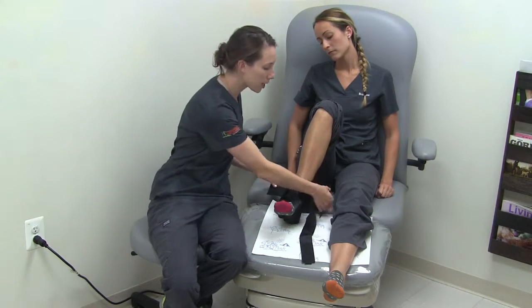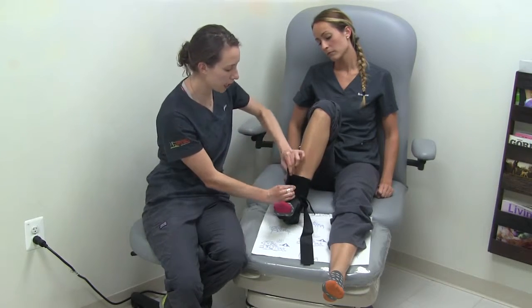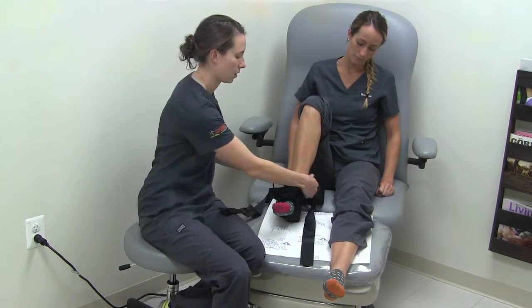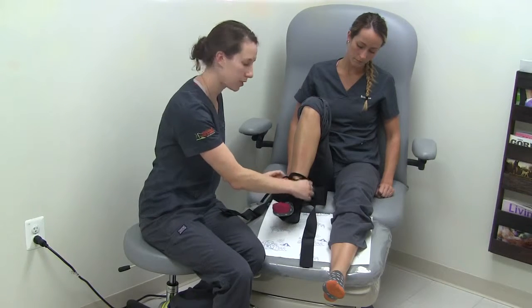To encompass the whole brace, you're going to take the first two straps and pull them tight together, making sure you secure all the straps all the way up to provide good compression.